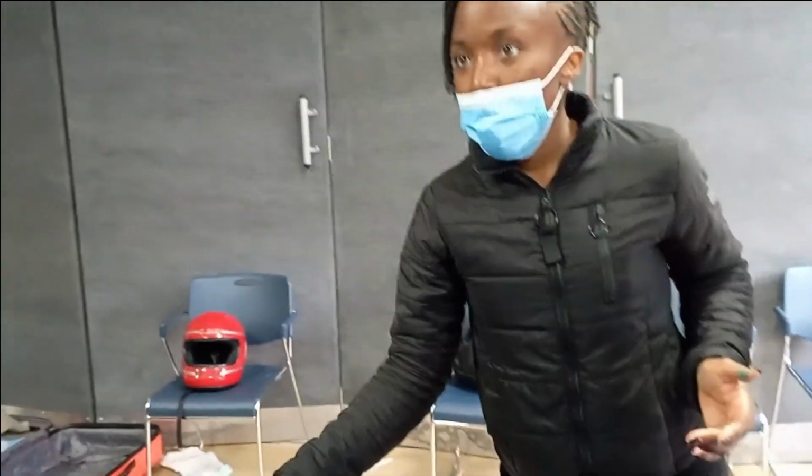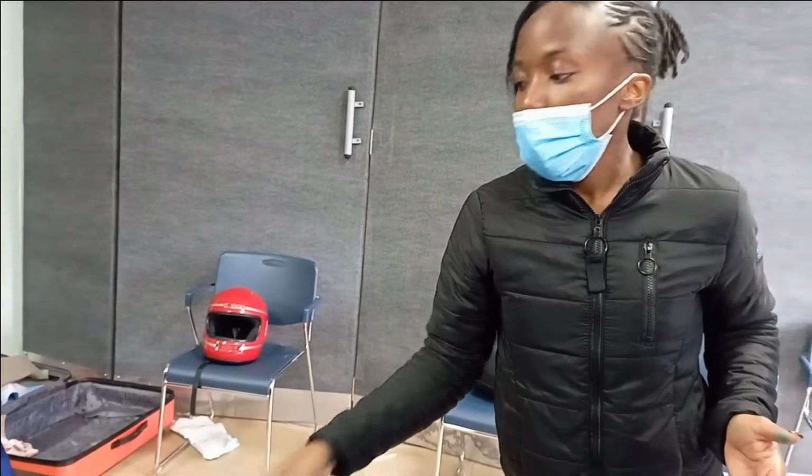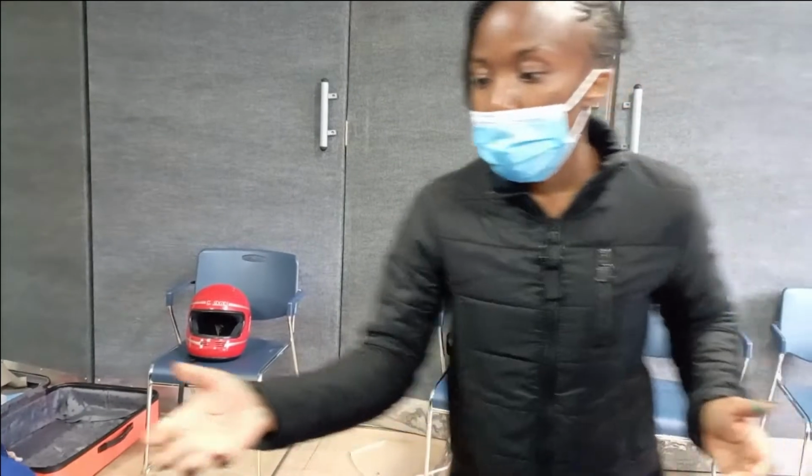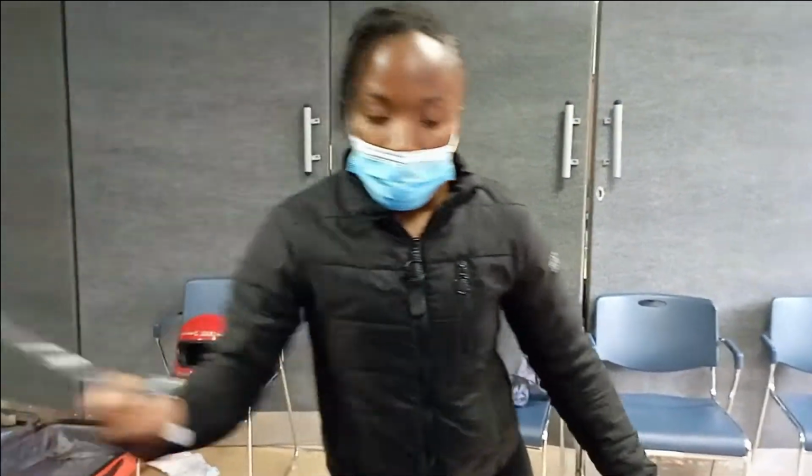Look at the small finger to size the tube. So you have brought a 6.5, a 7, a 7.5, and an 8 tube. Which one do you want? Give me all of them to assess. Okay, so we give them to you. So we get that the patient is a size 7.